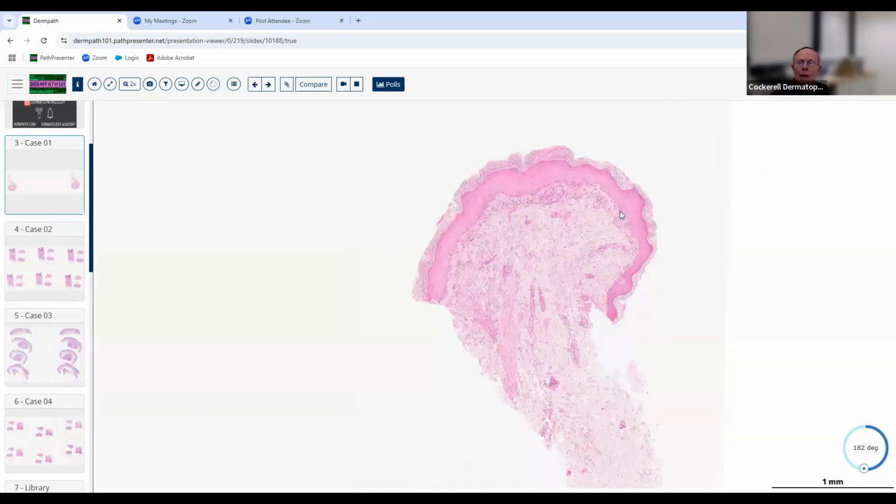What about the epidermis? Yeah, the epidermis, it looks like the basal layer had some liquefactive degeneration a little bit, and I saw some dyskeratosis, and some of the cells up there. And the epidermal rete are effaced. Oh yeah, it's kind of blunted, and there's almost no epidermal rete ridges here. It's got a little bit of acanthosis, which is kind of interesting.